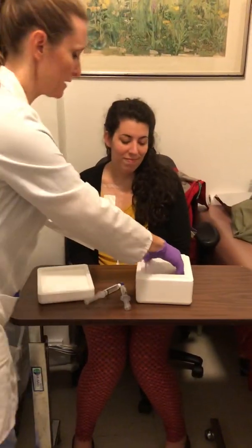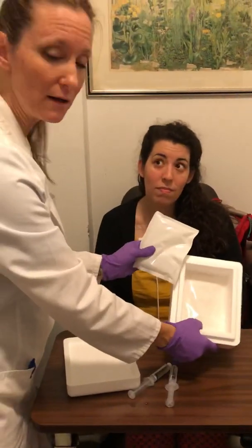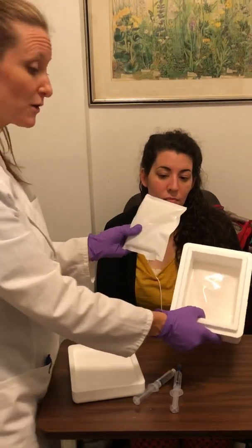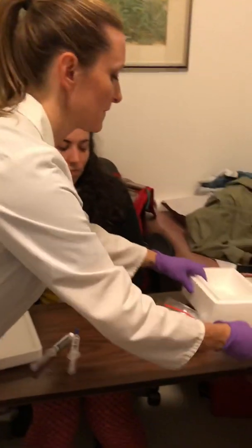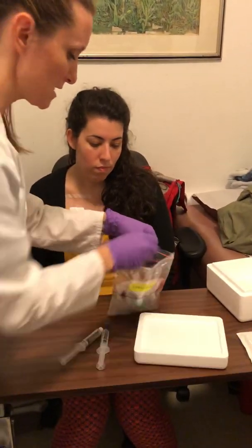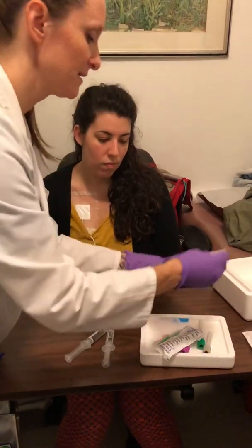In your kit you have ice packs — which aren't really ice, they're chemical — so these do not get frozen. Don't put them in the freezer or the refrigerator before you do this. These will keep the blood at the proper temperature. In your box and your bag you have the tubes and everything necessary to draw blood.